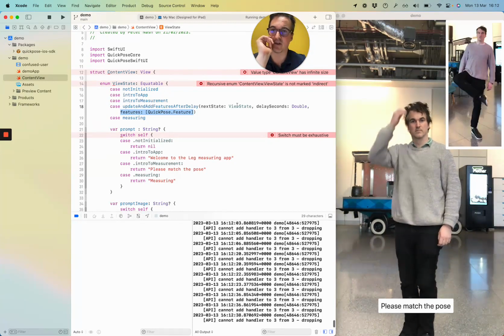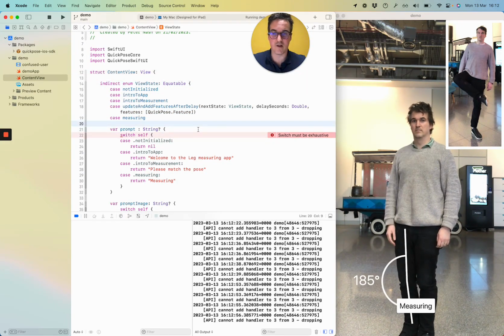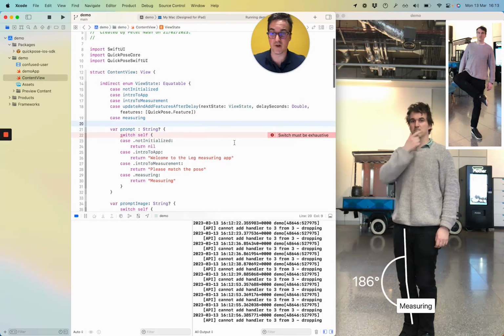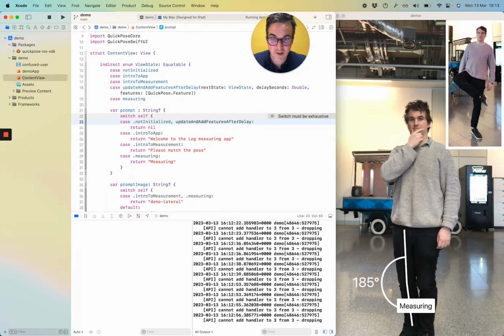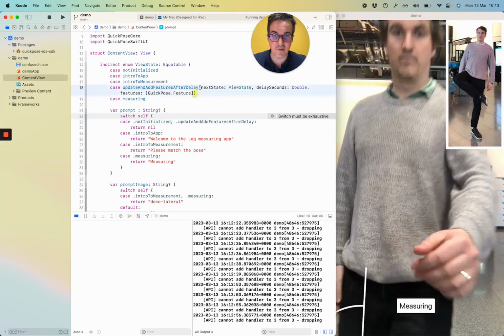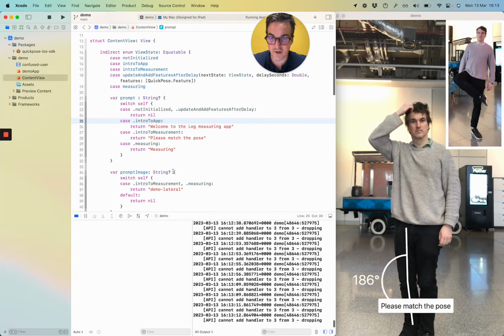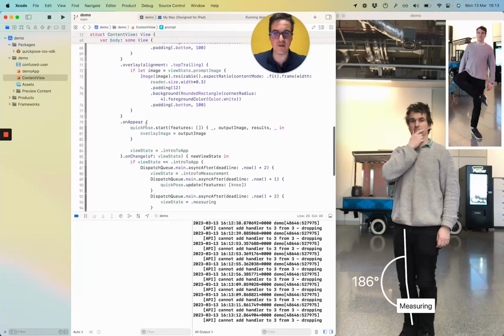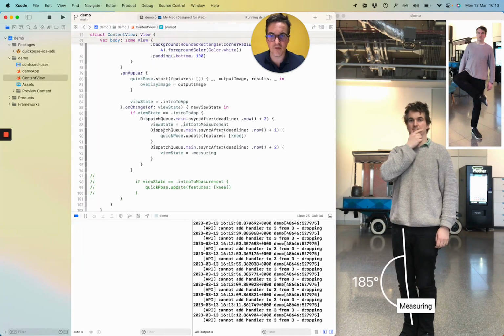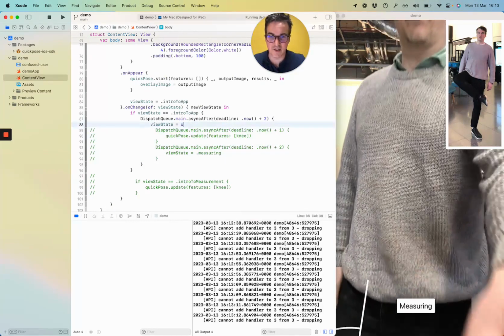Now we're getting a few errors on here. That's because the view state is referring to itself, so we need to stick indirect on here. Switch must be exhaustive. Fine, it is. Notice we don't have our new feature. Now you can actually skip everything in the brackets if that doesn't matter for your prompt. So we're going to return no prompt for that and no image. Great. Further down here though, this is where it starts to save a bit of time. I'm just going to do something quite stupid for now and assume something like this will actually work.